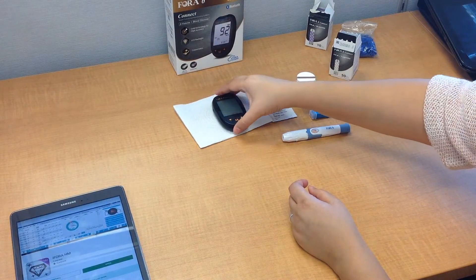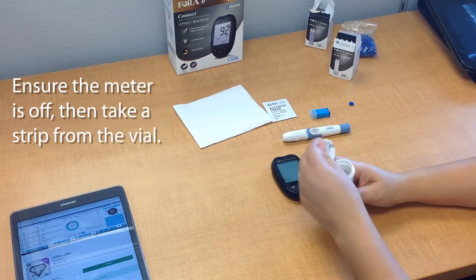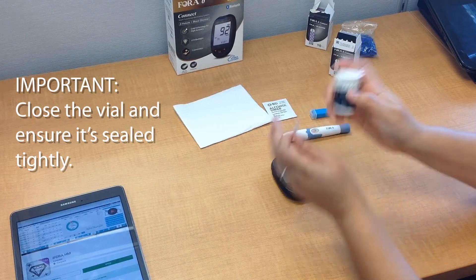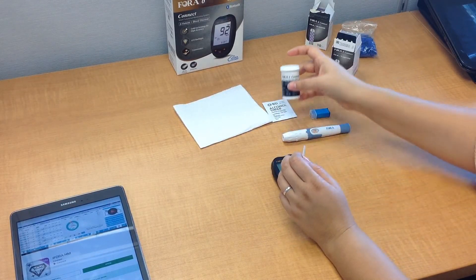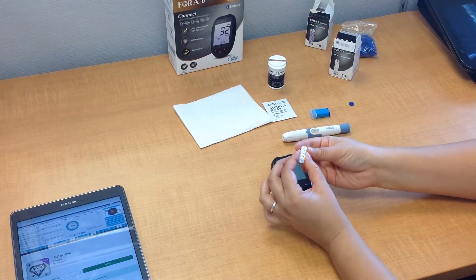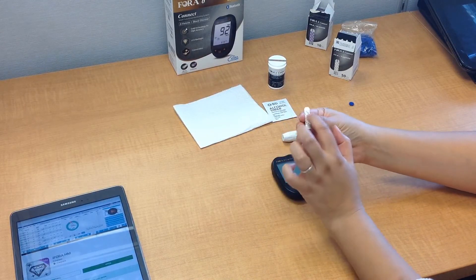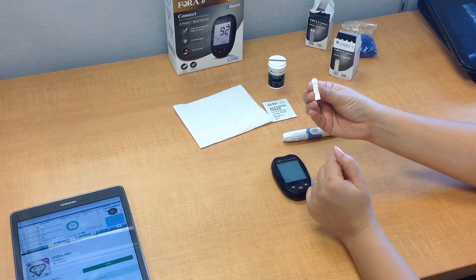Now, with the device set aside, go ahead and take a test strip from the vial. Take one out, and then it's very important that you close the vial tightly after you open it because air can actually contaminate the strips. So make sure that it's always tightly sealed. Then take the strip — you'll notice that there's a side with all of the Fora logo and then a blank side. This is the front side of the strip, this is the connector end, and then this is the absorbent end.